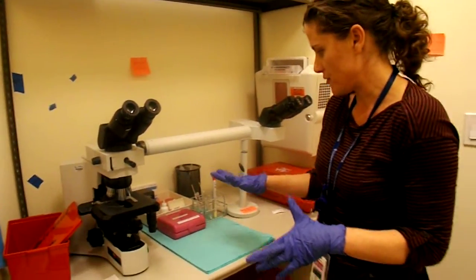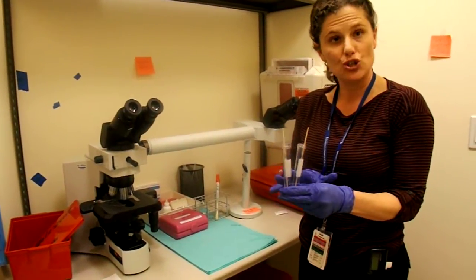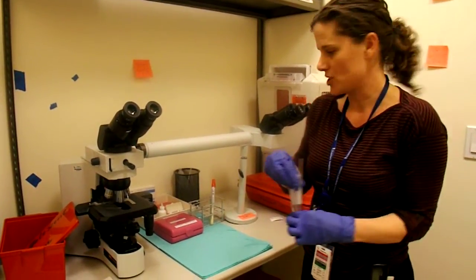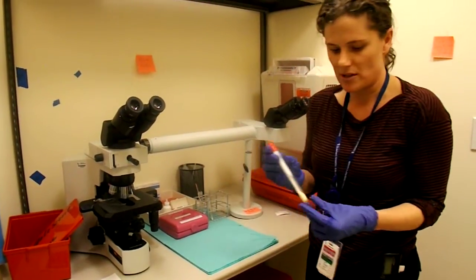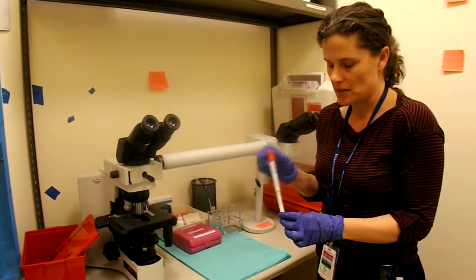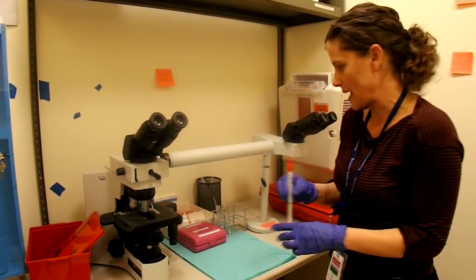You always can have different samples, but these are the samples you might most commonly have. A lot of people do it in these tubes. One may have saline and one may not. They should all be labeled. They aren't right now, but they should all be labeled with a patient's name. You can also do a wet prep and a trichomonas assay just by using these red top tubes, if you would rather. Sometimes we'll do self-vaginal swabs, so the woman will actually swab themselves, and this is usually what you use in that case.